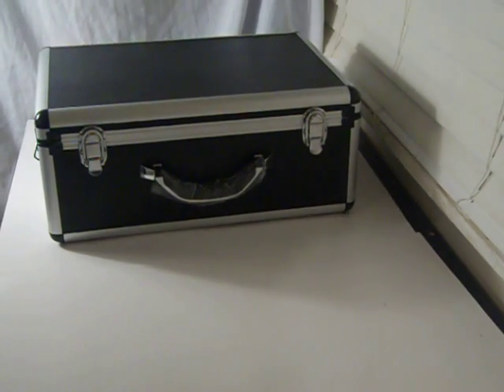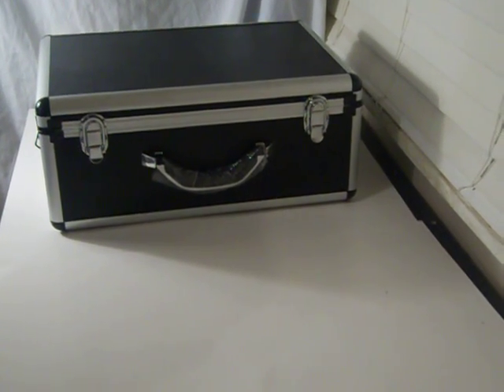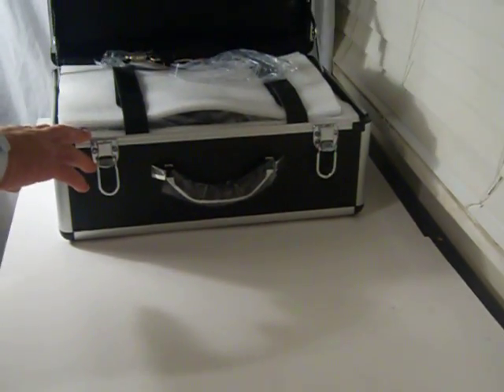This is the Veterinary Digital Ultrasound Scanner Model 3100. This is the best palm-size ultrasound scanner for rectal examination of large animals because it has the best picture.